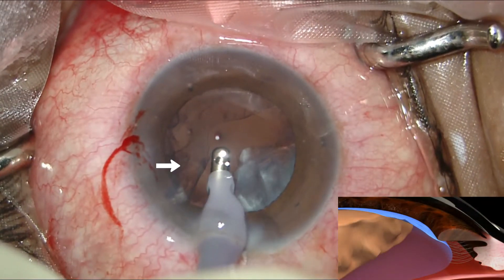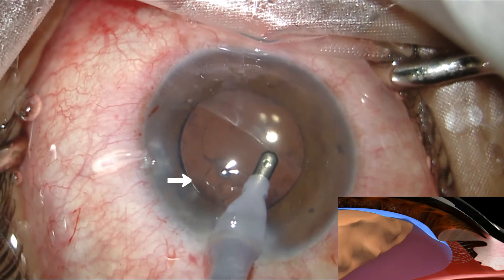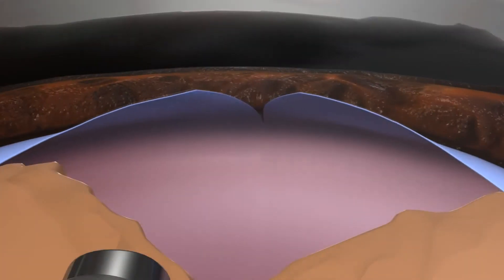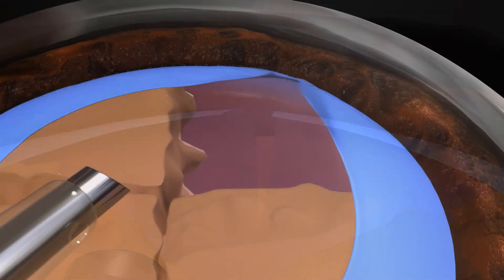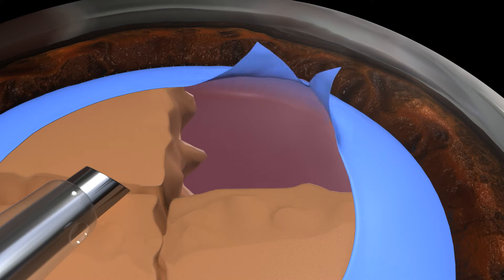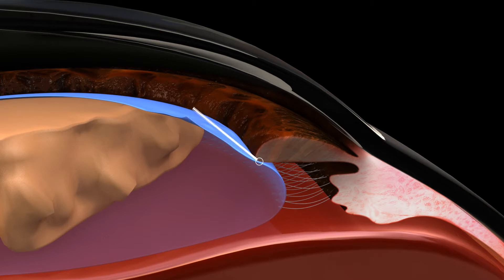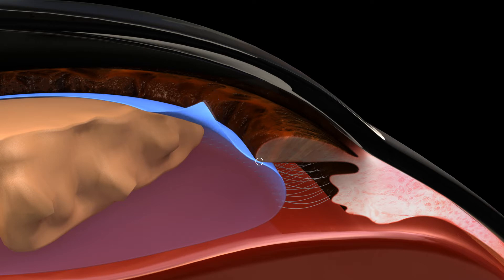We present a flap motility sign which conclusively helps to decide the extent of the anterior capsular tear. The anterior capsule tear can be either pre-equatorial or it can extend beyond the equator onto the posterior capsule. Pre-equatorial tears have averted and fluttering flaps. Phacoemulsification can be safely continued, as the averted and fluttering flap moves around the pivot formed at the endpoint of tear extension in response to the pressure gradient dynamics of the anterior chamber.